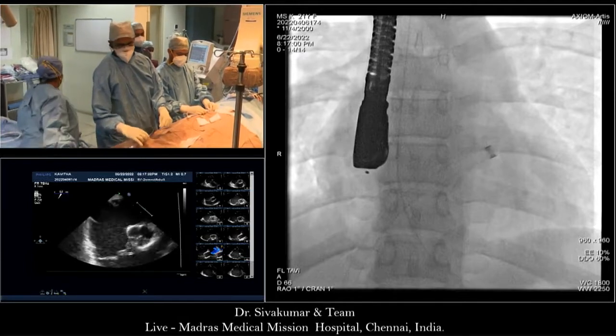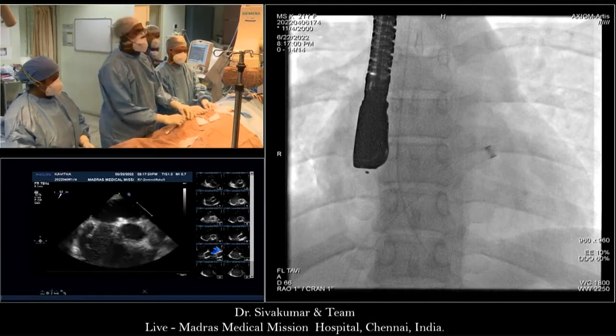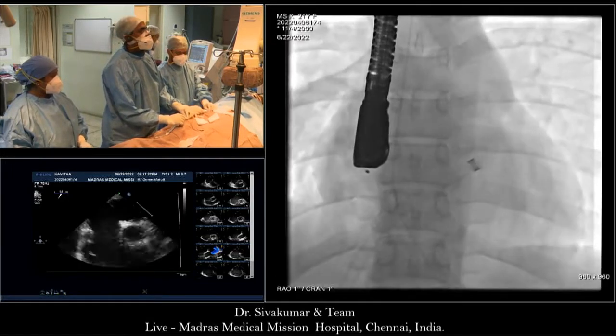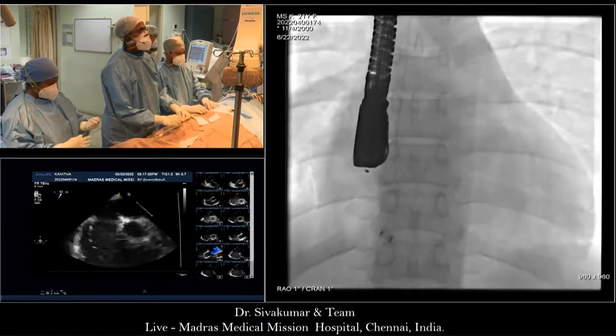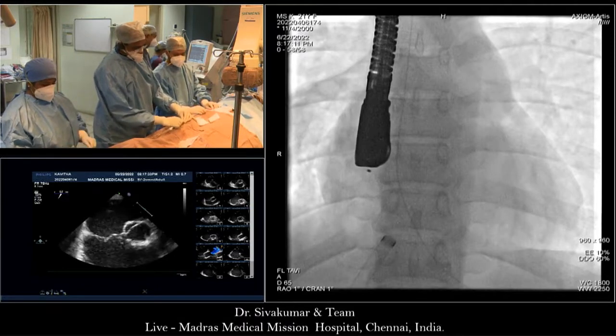Sister, get me that. I think that's pretty safe. So that's a very safe practice, not to poke around, to just take the time. That's a really good practice, Eva. Well done. All right, if this continues to protrude, would you recommend any other technique to use?